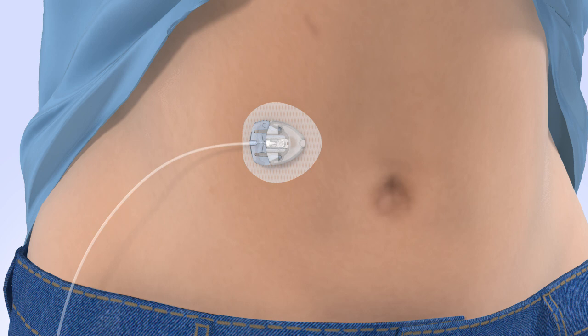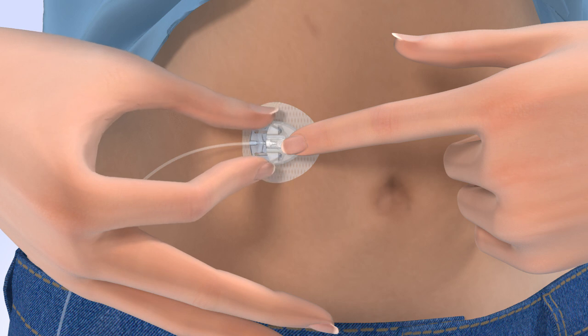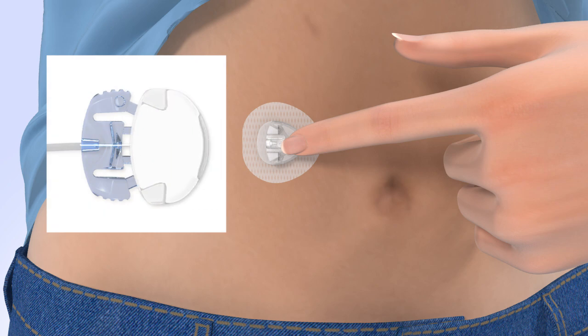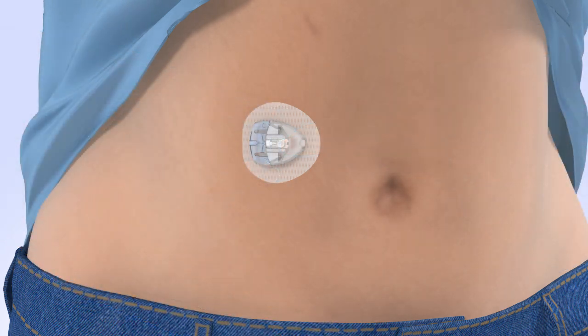From time to time, you will need to temporarily disconnect from your infusion site. Make sure you suspend your pump prior to disconnecting. To disconnect, gently hold the cannula housing steady with your finger, then squeeze the sides of the site connector and pull it away from the cannula housing. To protect both the site connector and cannula housing when disconnected, place the white cap on the site connector and the disconnect cover over the cannula housing. Both the site connector and disconnect cover will click when connected.